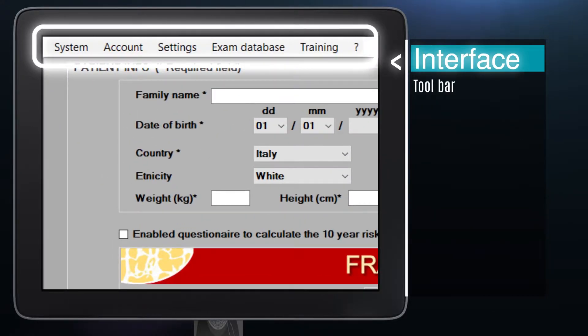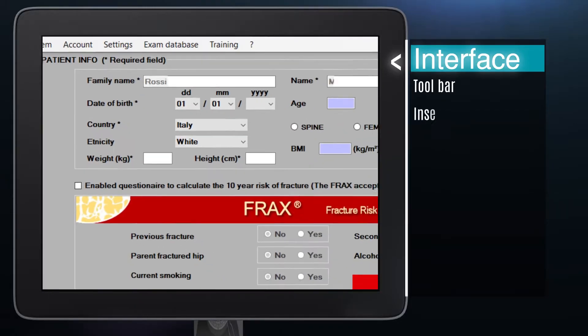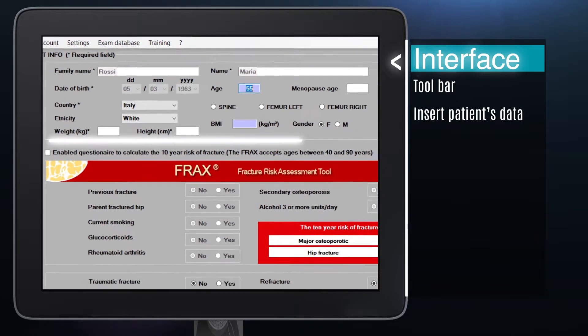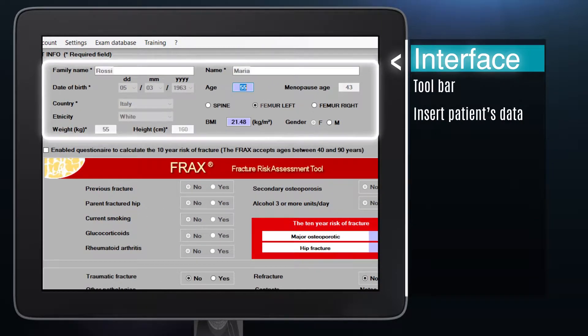After opening the ECOS Studio main interface, the toolbar is on the top. The patient's data form and spine or femur scan selection are in the section on the top. To get a correct body mass index or BMI value, it is recommended to insert precise weight and height values.